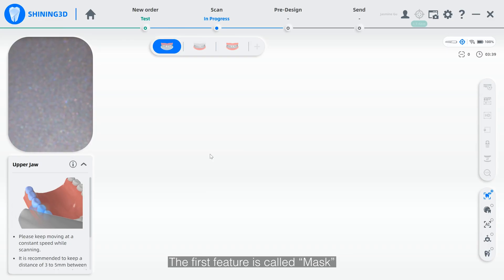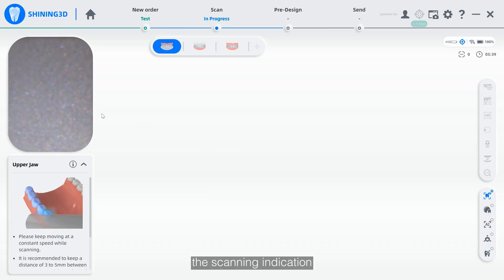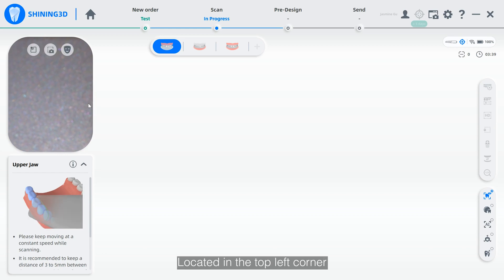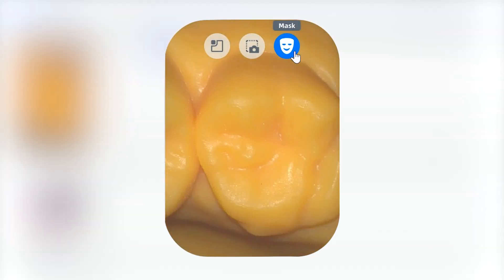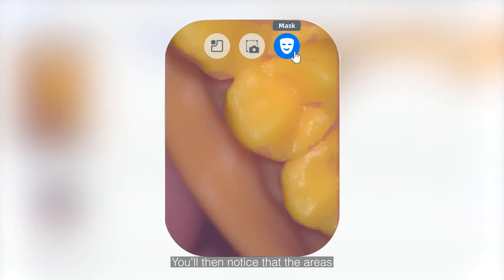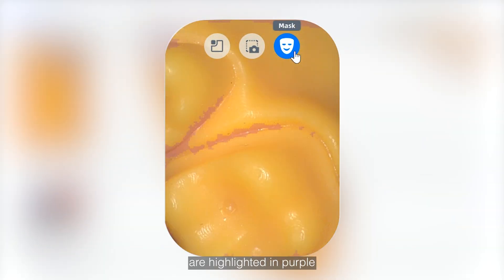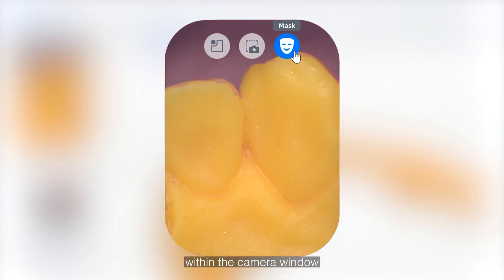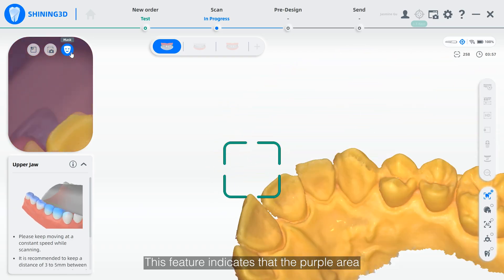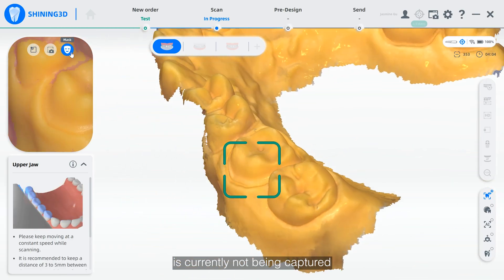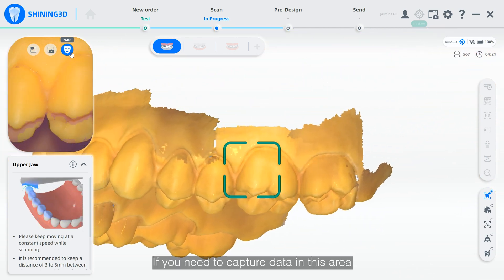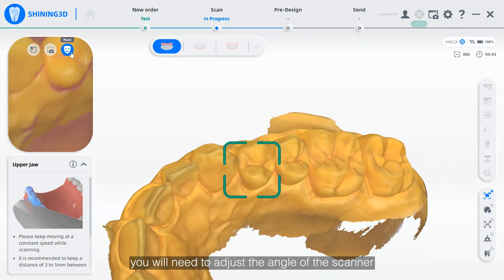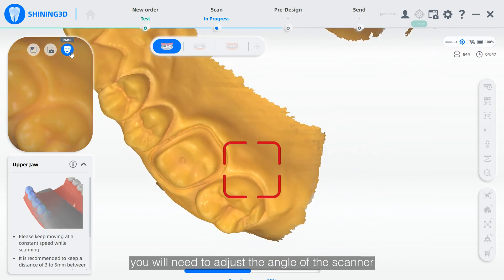The first feature is called a mask. The scanning indication is located in the top left corner of the scanning window within the scanning interface. Simply click to activate. You will then notice that the areas where data cannot be scanned are highlighted in purple within the camera window. This feature indicates that the purple area is currently not being captured at the angle of the scanner. If you need to capture data in this area, you will need to adjust the angle of the scanner.